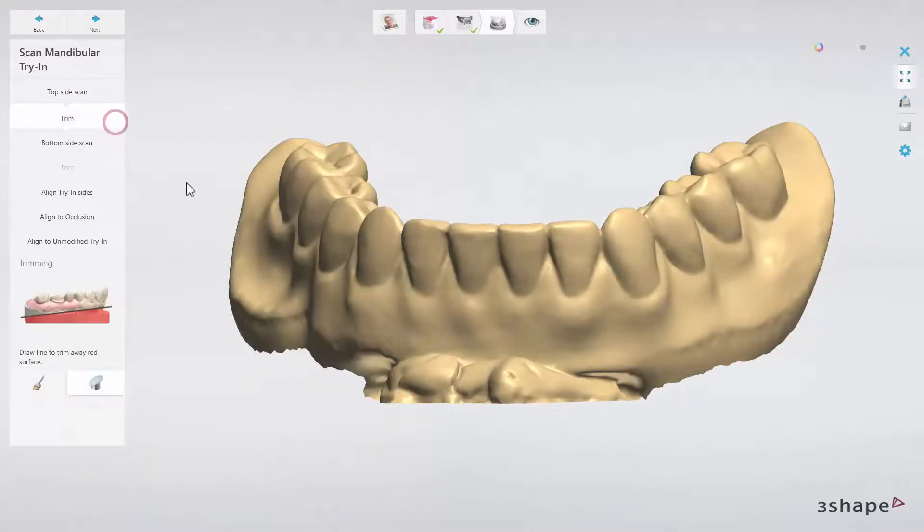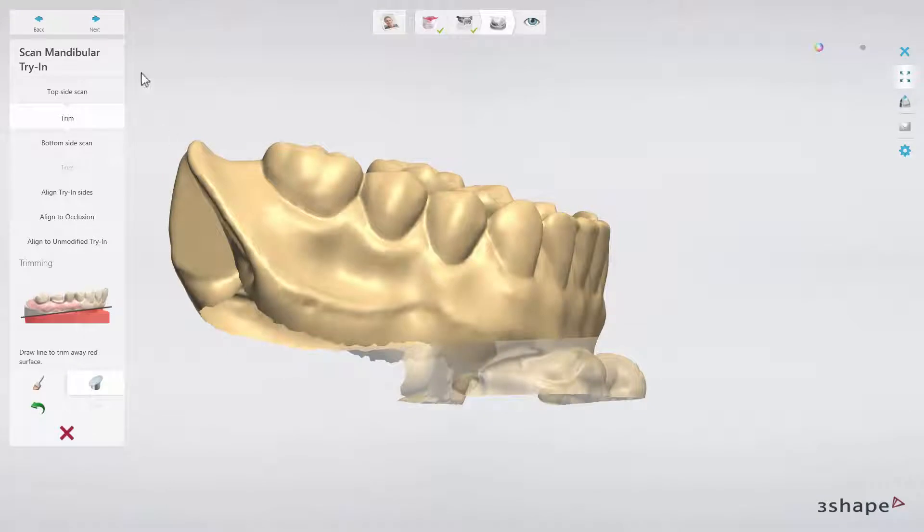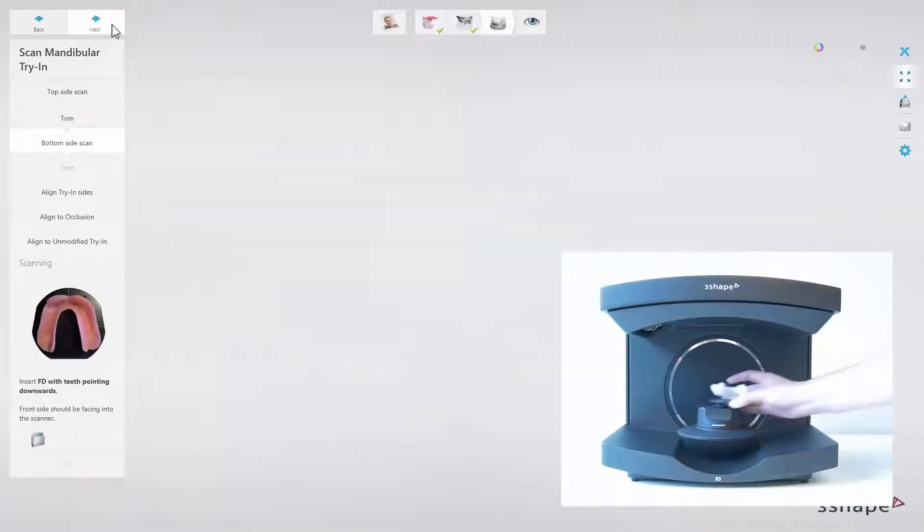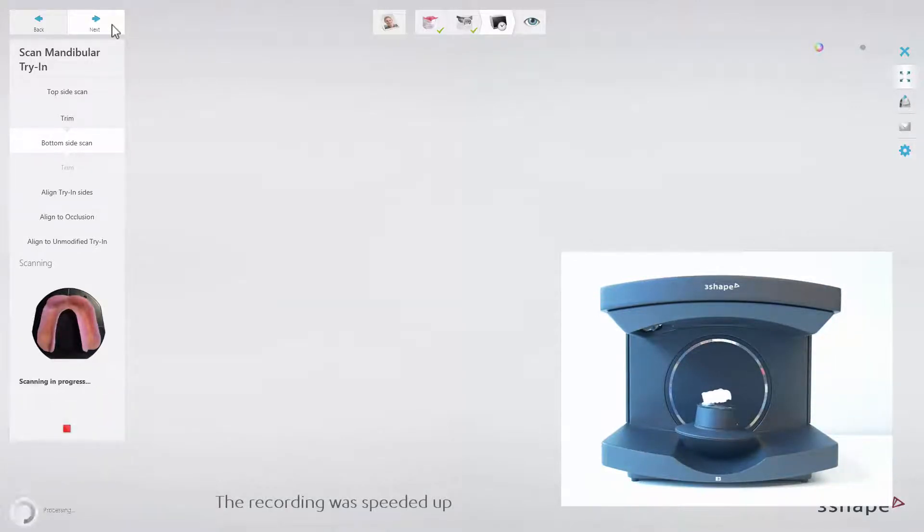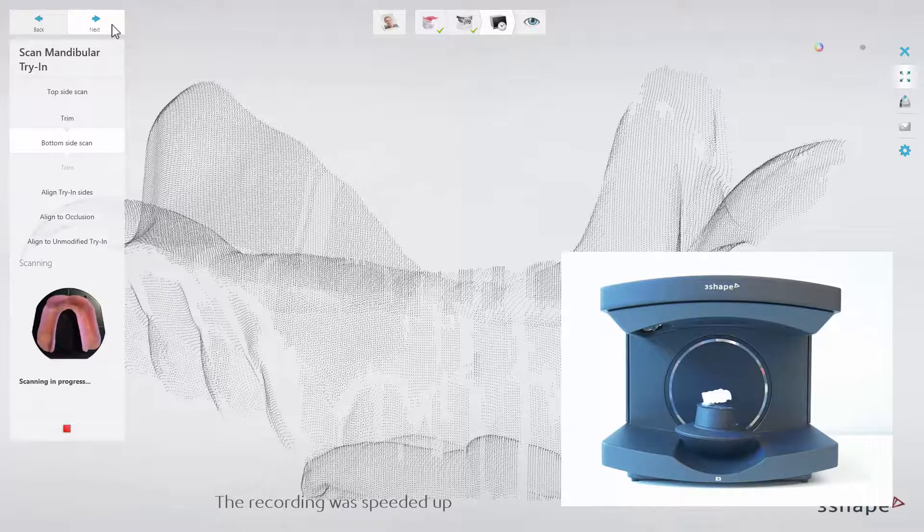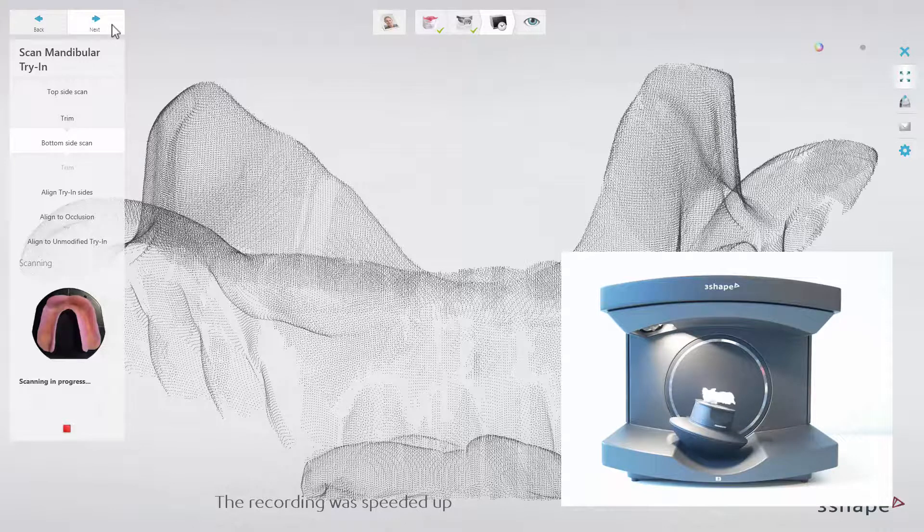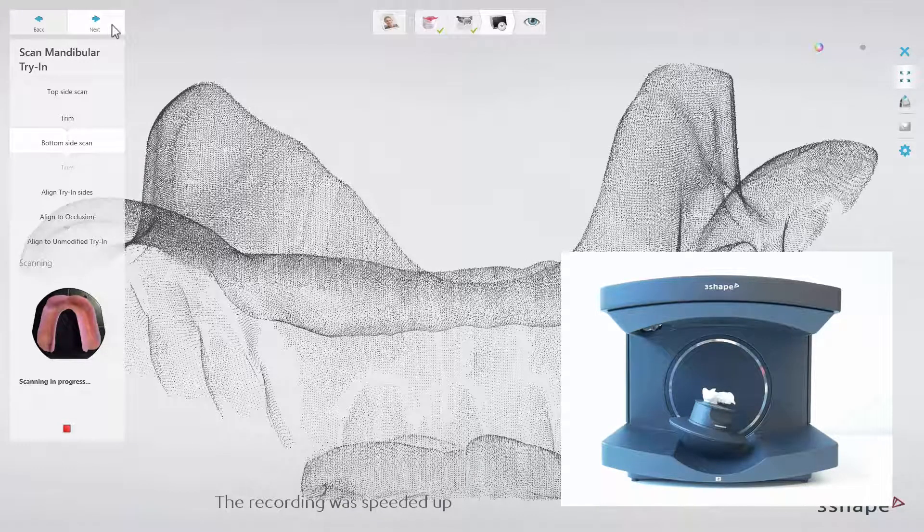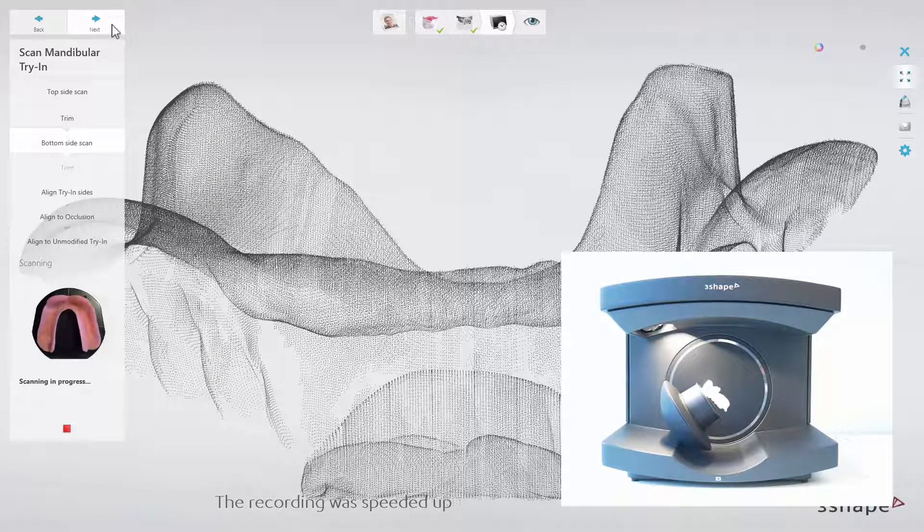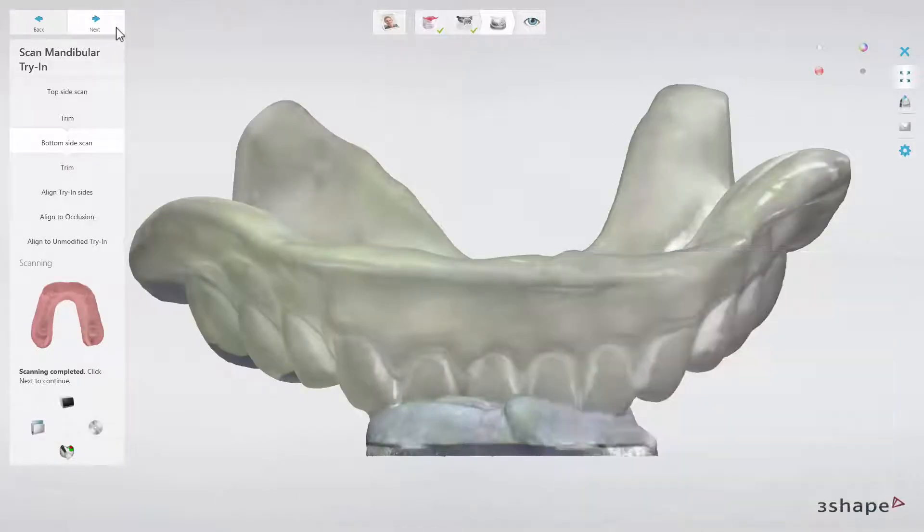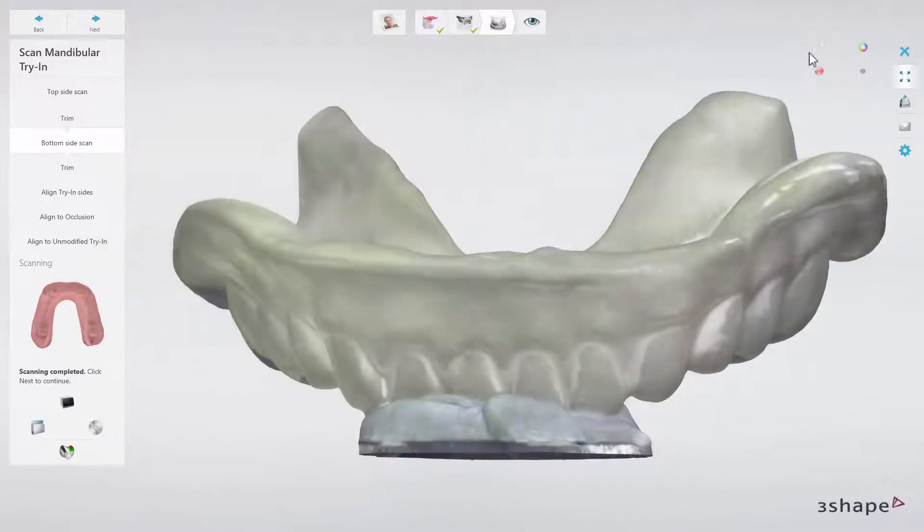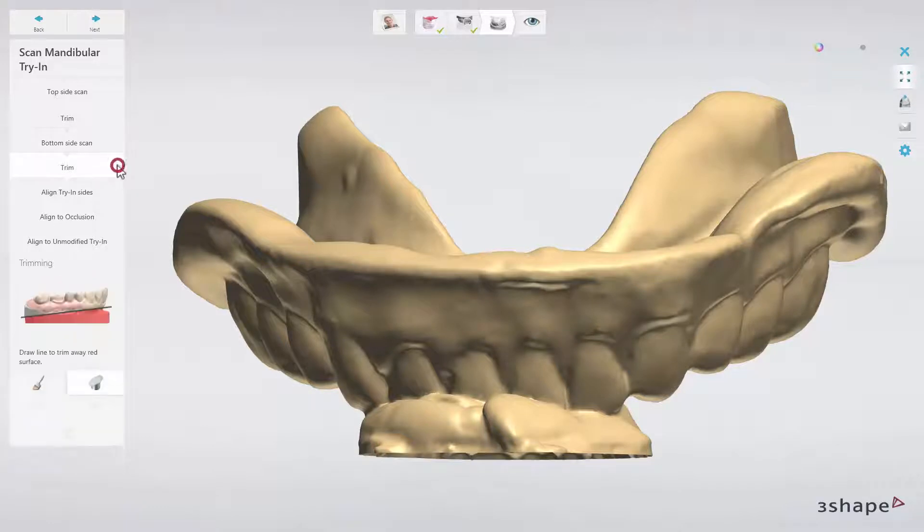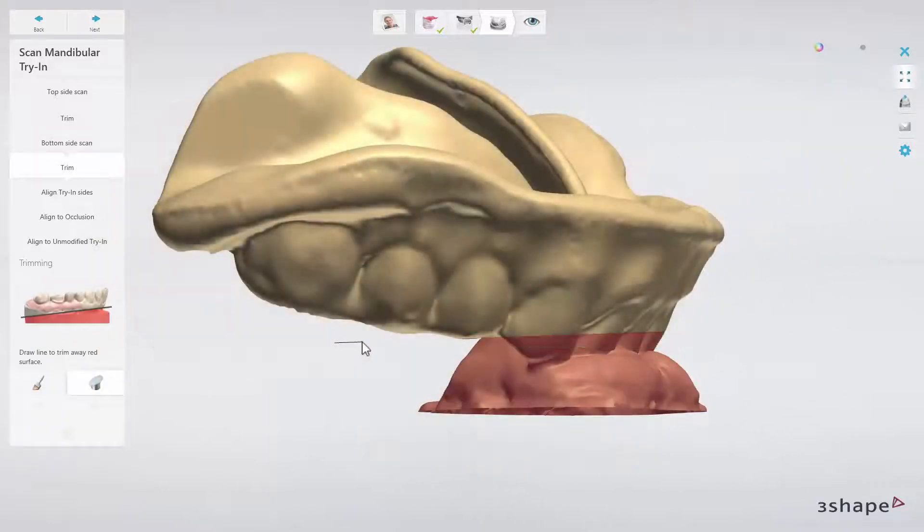When scanned, trim away the part of the scan that contains BluTac and click next. Now flip the denture to scan the bottom side. When scanned, trim away the part of the scan that contains BluTac and click next.